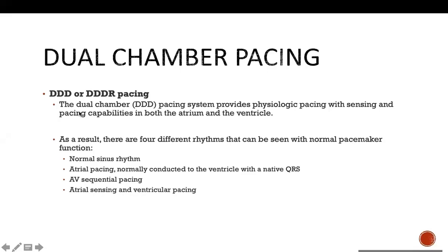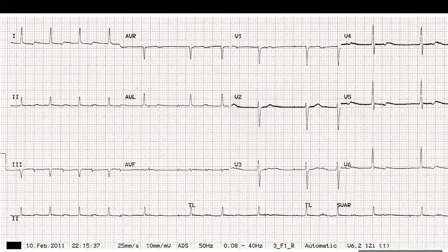Regarding the AV interval, it's very prolonged, 360. As we said, we try to minimize ventricular pacing. The reason we put in a device is to minimize the symptoms of the patient without doing any harm, whether the symptoms were bradycardia, fatigue, whatever. But we also try to minimize the disadvantages of having a pacemaker. If you pace the RV too much, you can get pacemaker syndrome and LV dysfunction. You might also deplete the battery and need to operate sooner for generator replacement. So the least harm you can do is better.